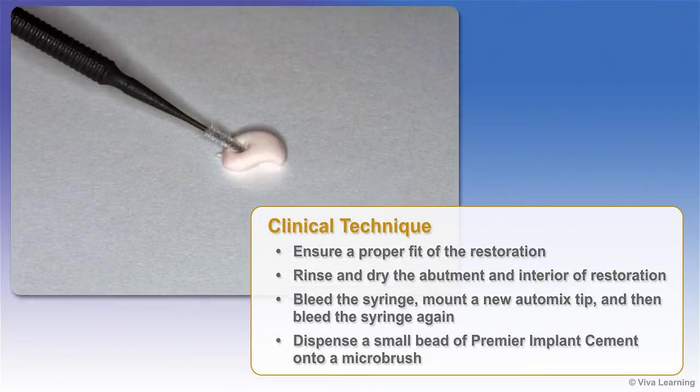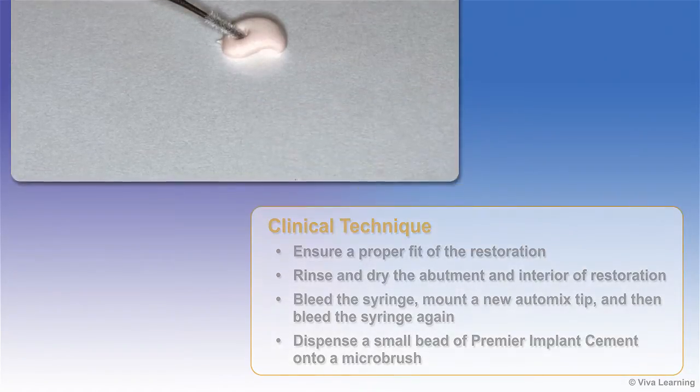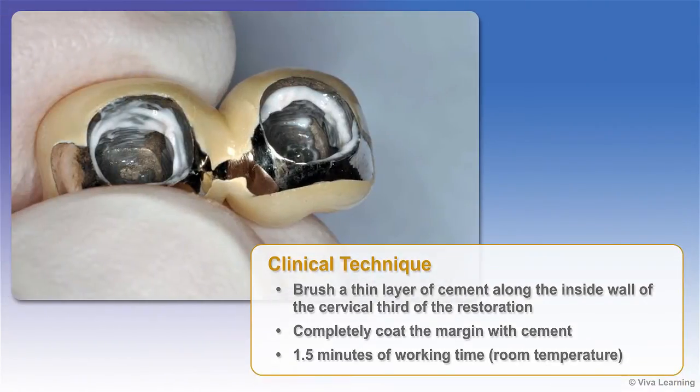Dispense a small bead of Premier Implant Cement onto a microbrush. Brush a thin layer of cement along the inside wall of the cervical third of the restoration, or up to the cervical half depending on the amount of retention desired, making sure to completely coat the margin with cement. This approach helps to reduce the amount of excess cement expressed apically while providing the desired retrievability.